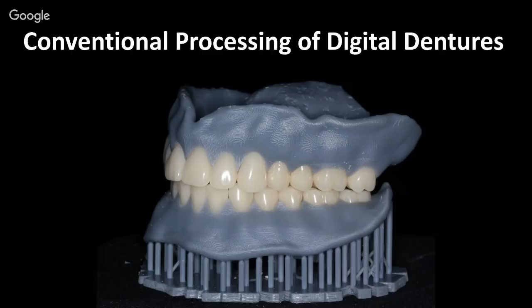So you've got the teeth cleaned and primed, you've got the base, hopefully you've cleaned and primed it, and then put on a bonding agent. So I would recommend the stuff from Annex Dent, and I apologize, I can't remember the name of it right now, but I would apply that to the teeth and to the base, and then I would get the 3D printer resin. So what I do is I shake up the printer resin, and I just pour a little bit into a little Dixie cup.